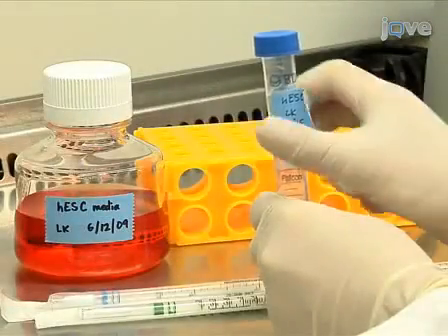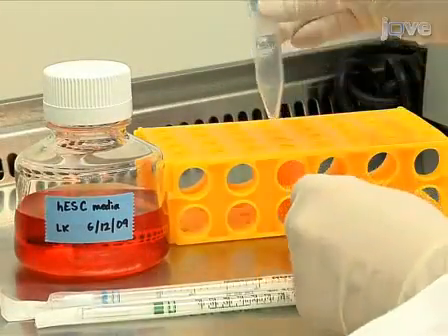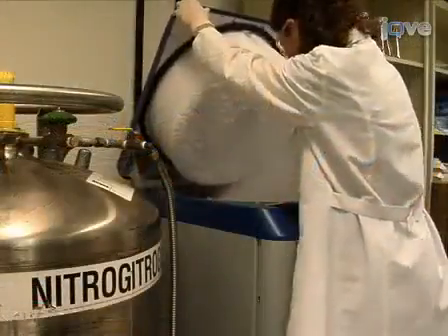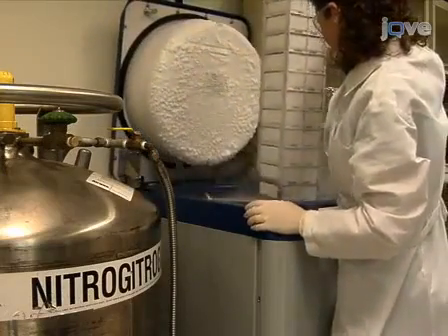To ensure an efficient and successful thaw, be sure to have all necessary equipment and reagents ready before removing the human ES cells from liquid nitrogen.